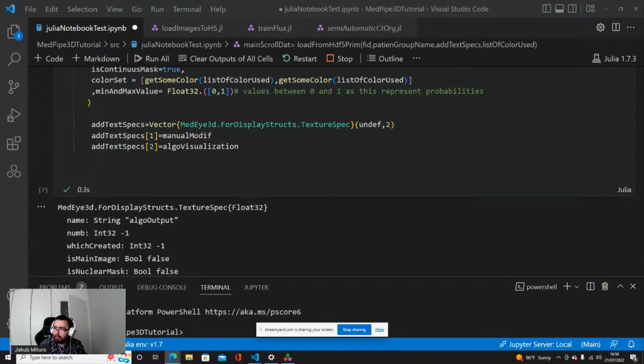Okay, so I will not lie to you. I do not know anything about Macs, yes, and basically how macOS is working. But I see that OpenGL can be installed on macOS. So in terms of the tech stack, yes, it's based on OpenGL and GLFW.